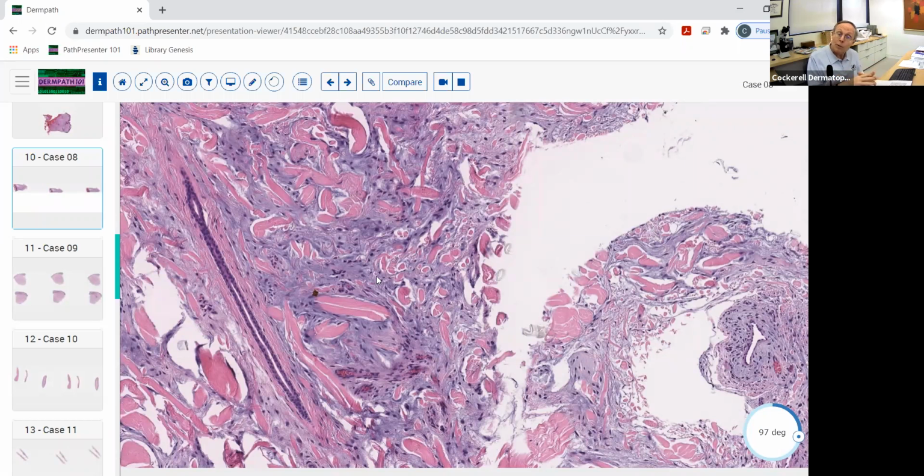If you get abundant mucin with no fibroblasts, or just a few scattered fibroblasts, that may be just a cutaneous myxoma. If you do a shave biopsy of the distal digit overlying a joint, you may get abundant mucin there that may have a small, fine, delicate lining at the periphery. That's basically a digital mucous, quote, cyst, quote, which is not really a cyst at all. It's basically a contiguity of the joint space with this mucin that gets deposited. And it's mainly due to people that have osteoarthritis.